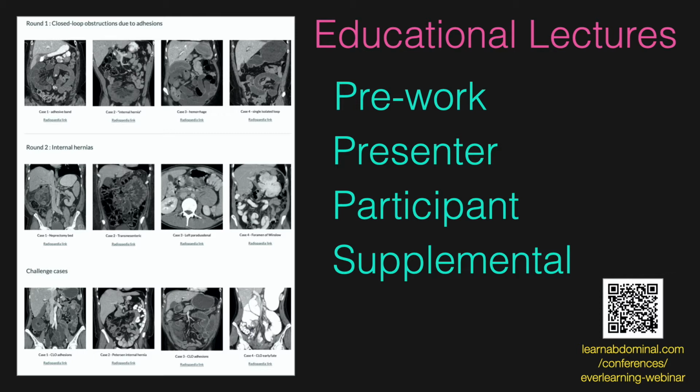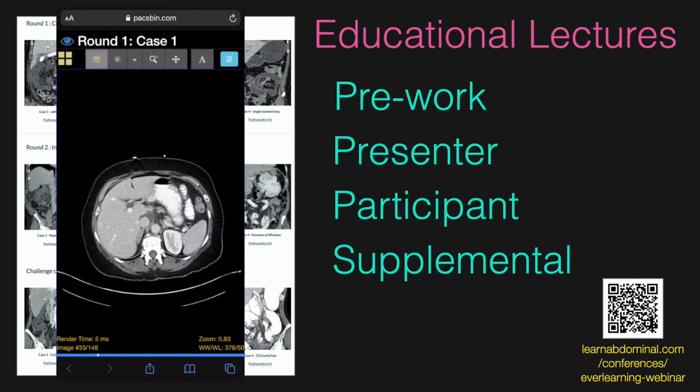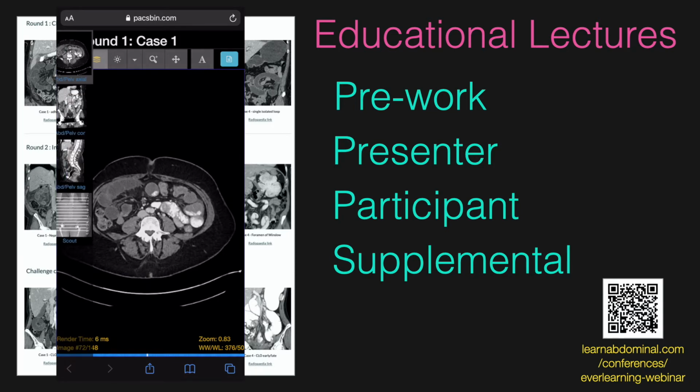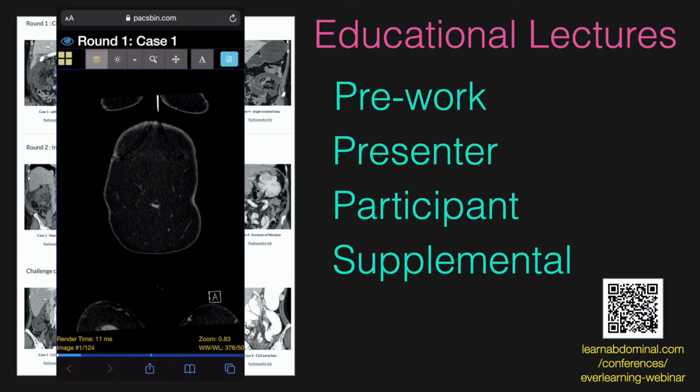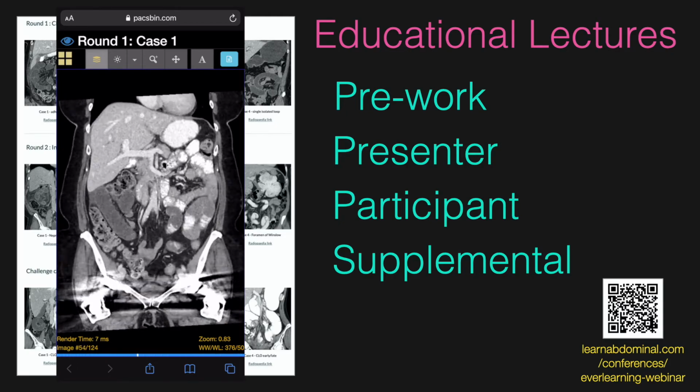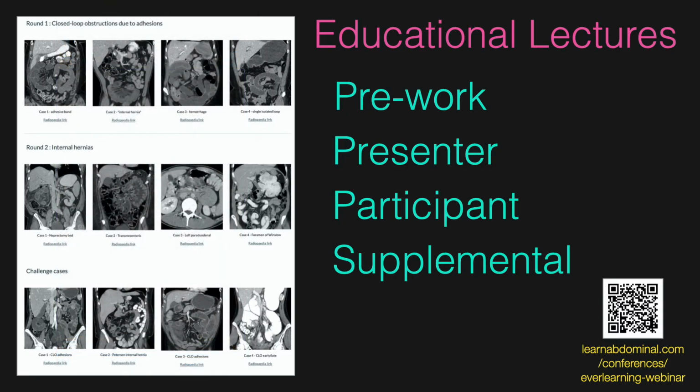Third, I linked most of the cases out using QR codes so that the participants could view the cases in real time, which is the same concept that I just showed with the digital posters. This admittedly works best for on-demand viewers who can pause the video, as the pace of my review does not really allow enough time for personal scrolling.